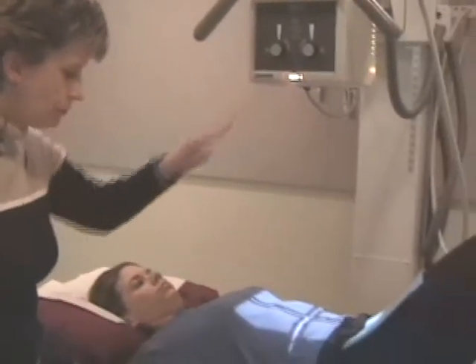Notice I said that 2 different ways. Center of the film is 2 inches above the iliac crest, or the iliac crest is 2 inches below the center of the film. Make sure you can talk either direction. It all ends up being the same. Let's look at our patient now. We're almost done with this projection.